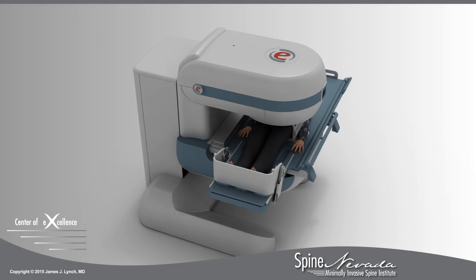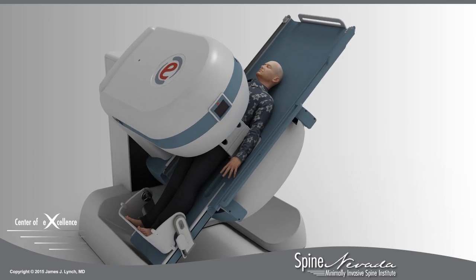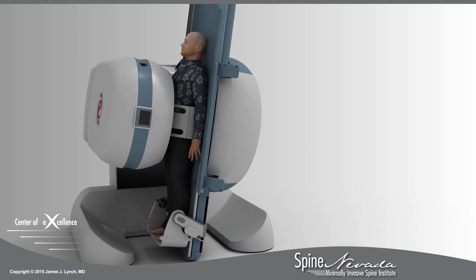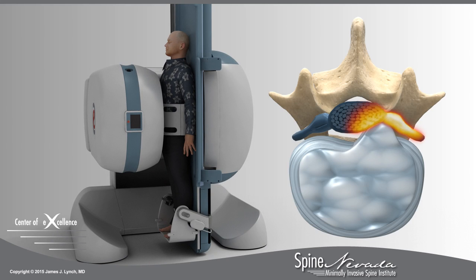At Spine Nevada, we use a stress test MRI to examine the spine in both supine — lying down — and while bearing weight, sitting or standing. This allows doctors to observe how a patient's body weight applies pressure to the injured discs, pinching the nerves and causing pain.